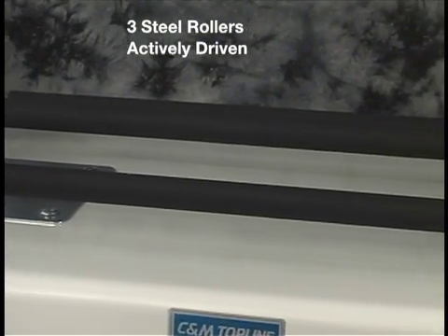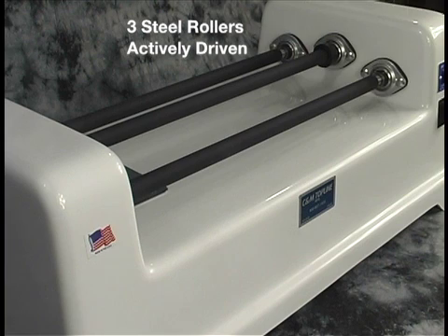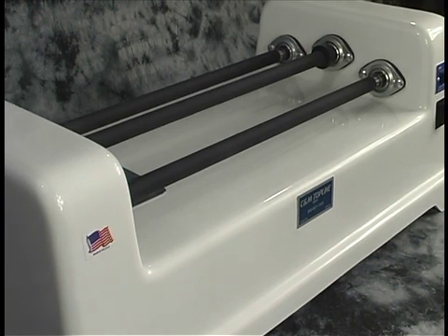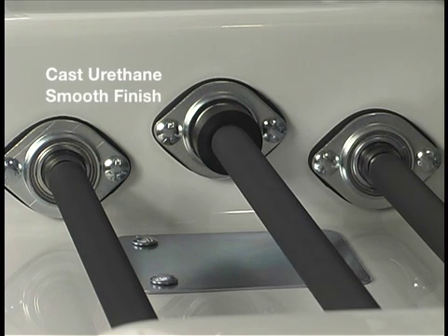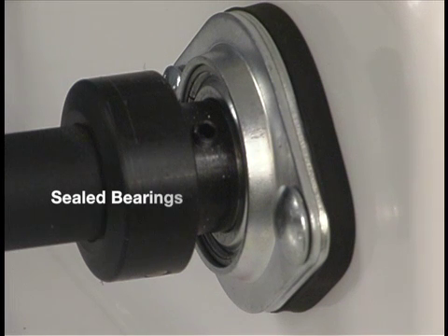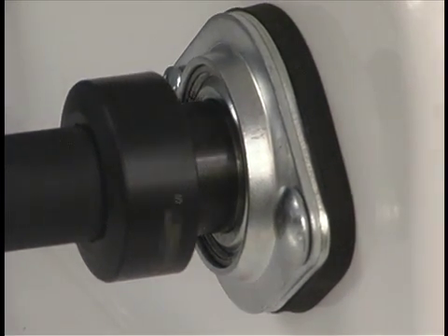It has three rollers made of solid steel that are all actively driven. These bars are cast in urethane and then ground to exact diameter and smooth finish to ensure uniform performance. They are supported by high quality sealed ball bearings.